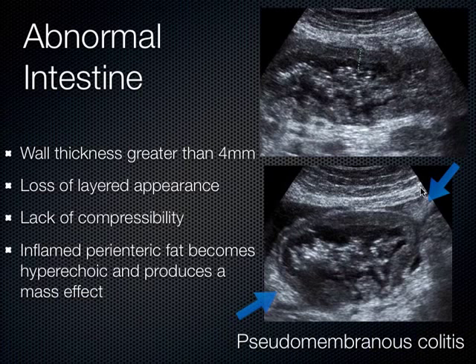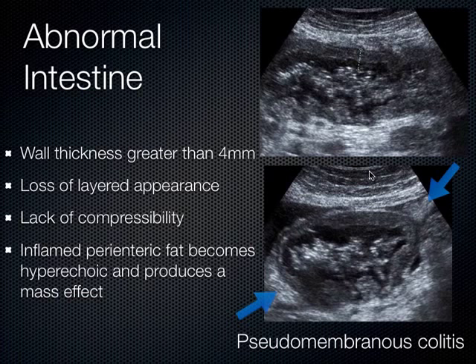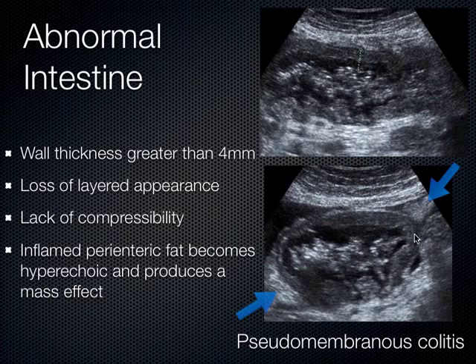In this patient with pseudomembranous colitis, we can see this hypoechoic area here and also adjacent over here. In real time when you go to compress this, all this perienteric fat gets tacked down together and moves together — not unlike patients with cellulitis where you see hyperechoic islands we call cobblestoning. Whenever there's inflammation anywhere in the body, it appears as hyperechoic areas on ultrasound.